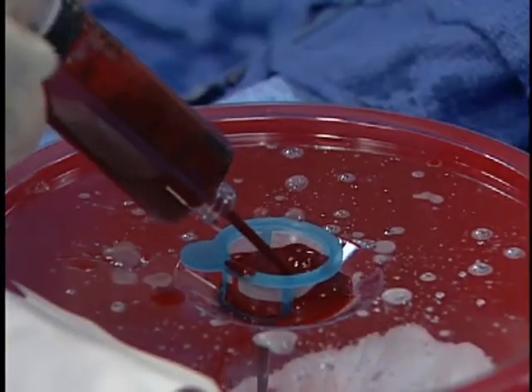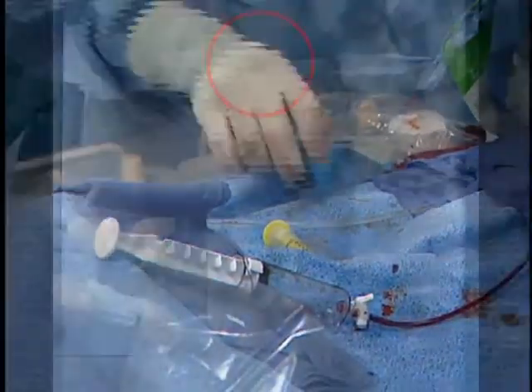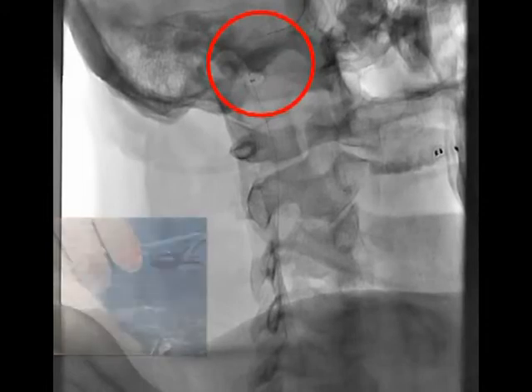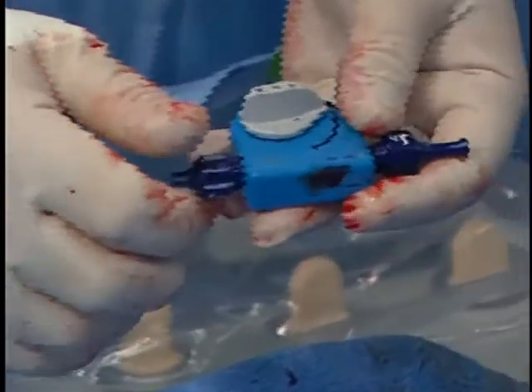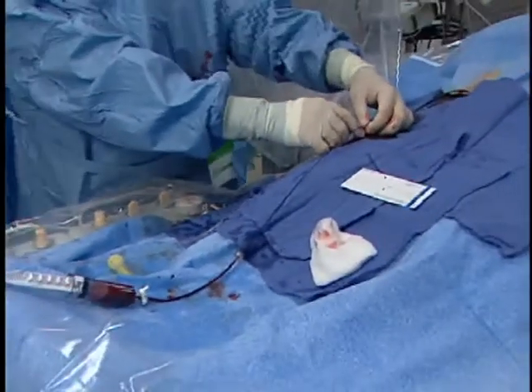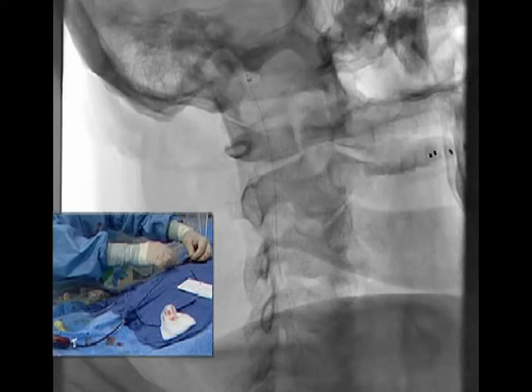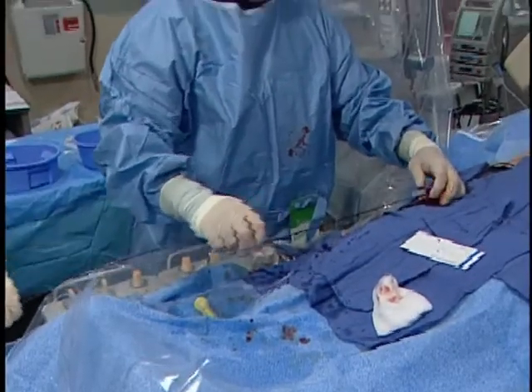We'll filter this out and see if we got anything in there. Now we're going to take a clean syringe and hook this back up on negative, start aspirating, and take the filter down. You can see the radiopaque portion separate — our filter is now back down. I'm going to take this off the vice grip and retrieve this back into the filter. Now our filter is back into the aspiration catheter and I'm going to pull all this out.